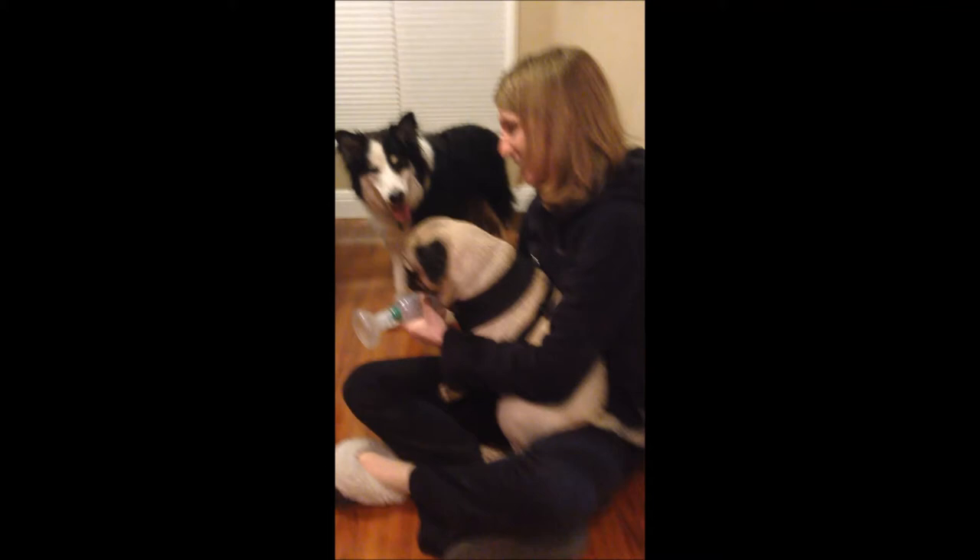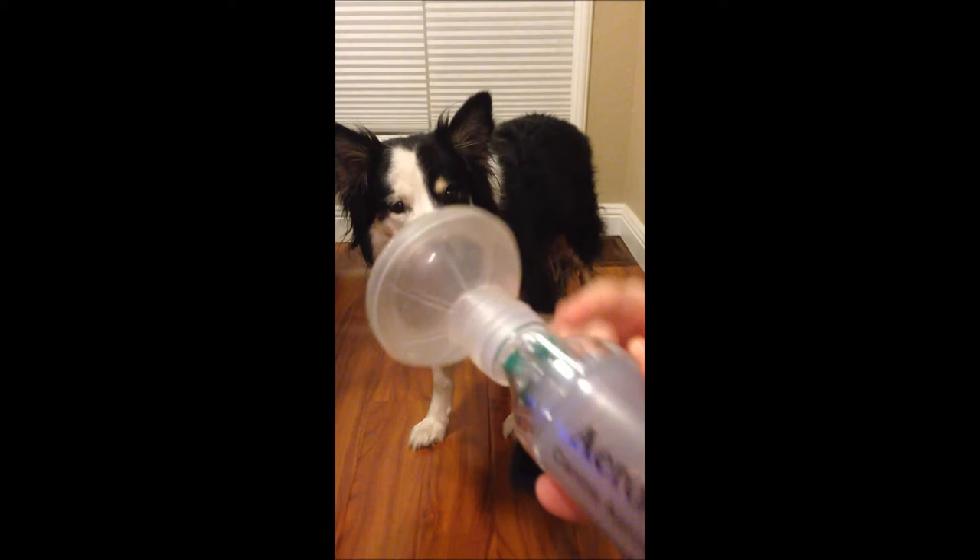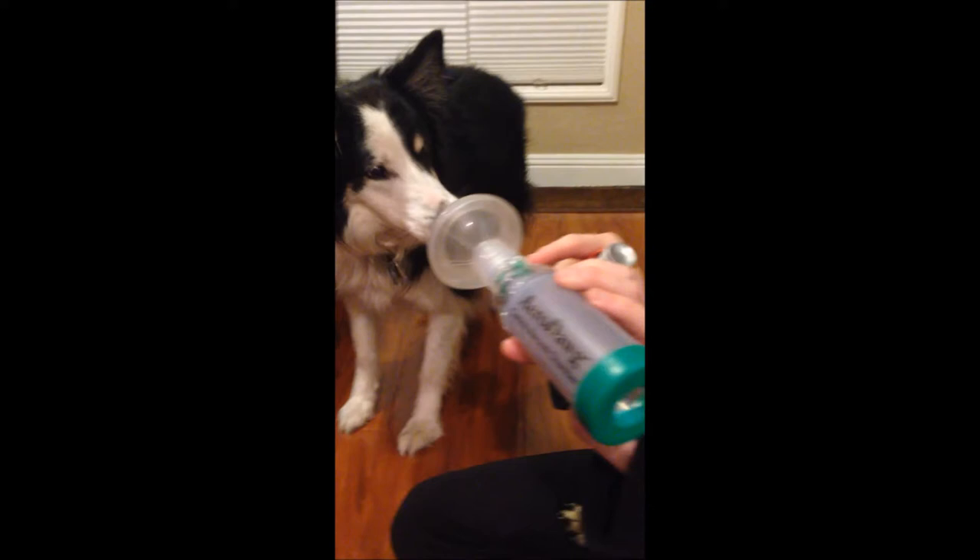I have to convince him to do it. You take the little cap off and then — so this is the regulator piece. On one side it comes up and then on the other side it's just smooth. This is going to tell you if he's actually using it appropriately.